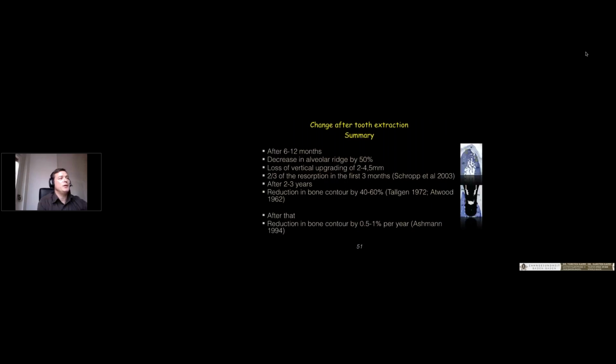These are some cases we knew before, showing changes after tooth extraction. I told you before, if you make an extraction of the socket and put nothing inside, this is the normal technique from before, then you lose 50% of the bone. As you know, the classic technique from Daniel Buser is to make an extraction, wait 6 or 8 weeks, and then make an implantation. In all these cases, you have to make an augmentation, because if you make these techniques, you're losing bone.